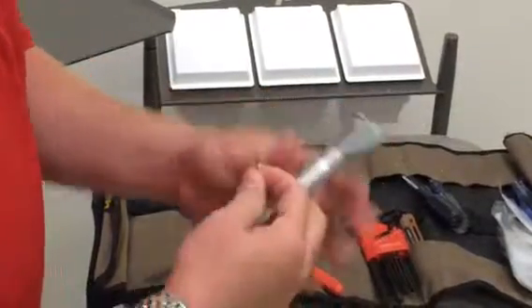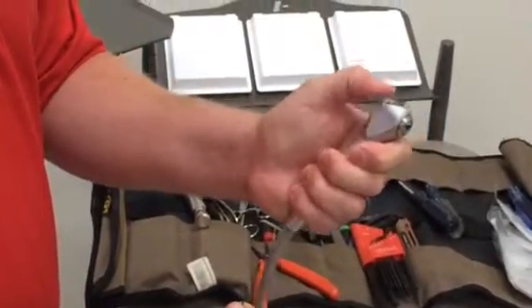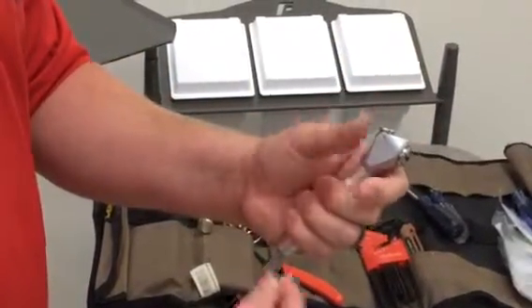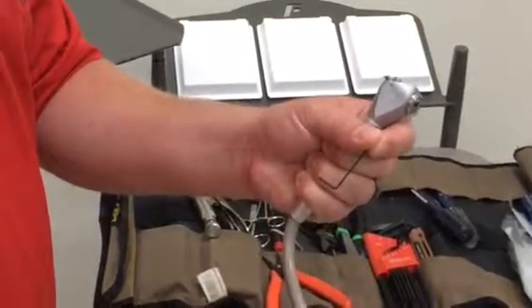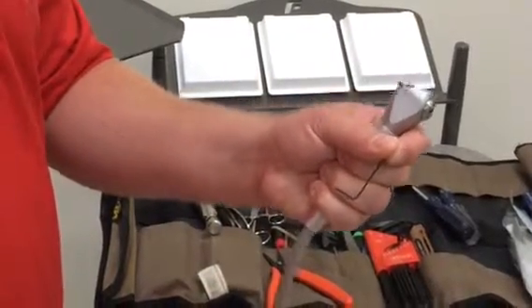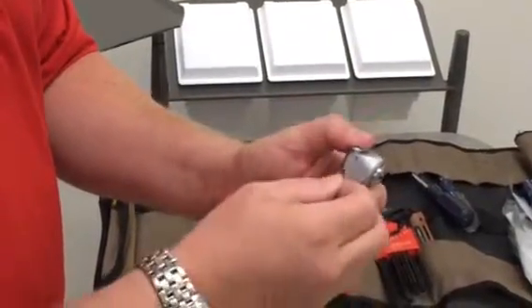And you start by flipping off the master switch on the unit. You want to make sure that there's no pressure behind the buttons so that they don't become a projectile. And then as an added safety measure, I will sometimes go ahead and clamp a hemostat on the line just to make sure that if there's any pressure leaking through, it's not building up, again, just for safety.